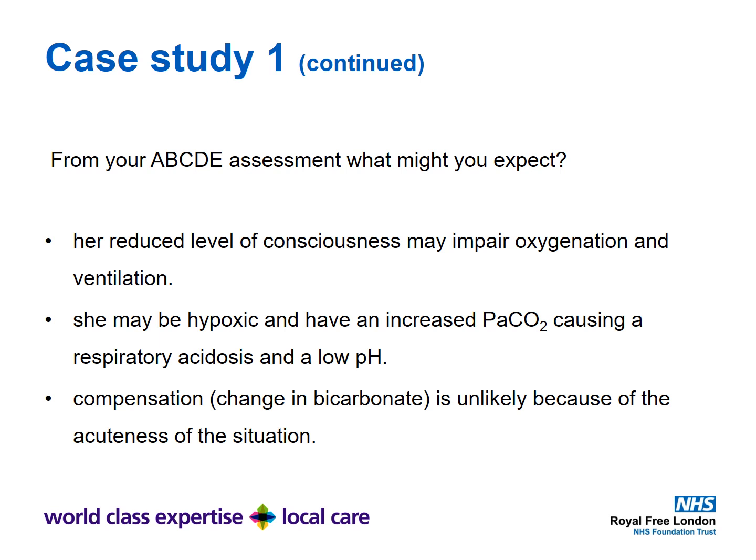So she has clearly a reduced level of consciousness as determined by the presence of the oropharyngeal airway. So she's had a significant head injury, and this will impair her ability to ventilate. The significant head injury is also evidenced by the Cushing's response, which is seen by the bradycardia and the hypertension. So her reduced level of consciousness will impair her ability to oxygenate and to ventilate. Now imagine being thrown off and kicked by a horse. You're likely to get significant thoracic injury, so she could be hypoxic from significant lung injury, so haemopneumothoraces, flail chest, broken ribs and so on.